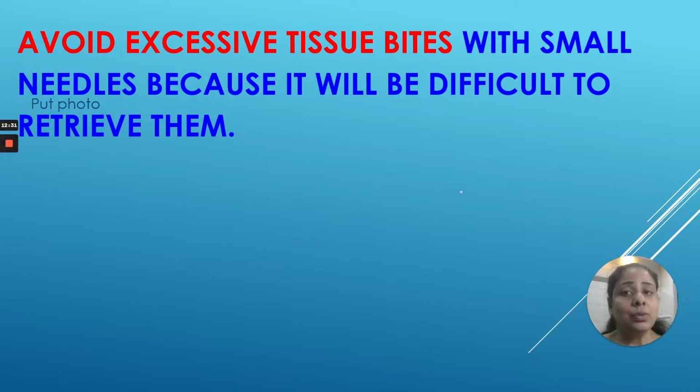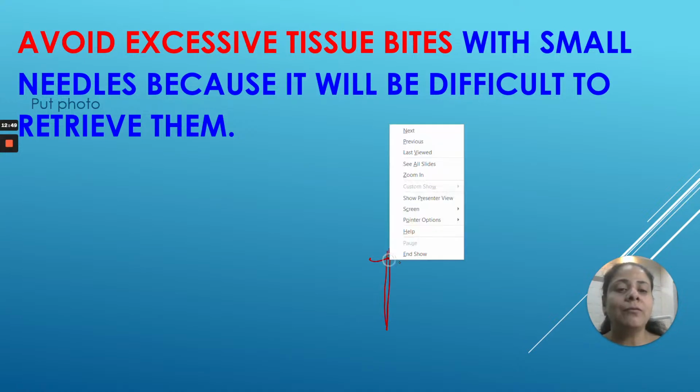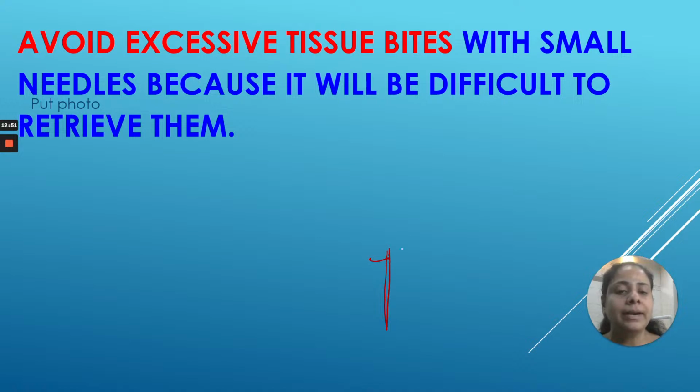Avoid excessive tissue bites with small needles because it will be difficult to retrieve them. Suppose this is the incision line, and you are taking too big a bite, so the needle point will be here and the whole of the needle will be embedded in the tissue itself. It will be very difficult for you to grab this needle point and take it out. So in most cases, 2 to 3 mm of bite is more than enough. Do not take bites more than that.